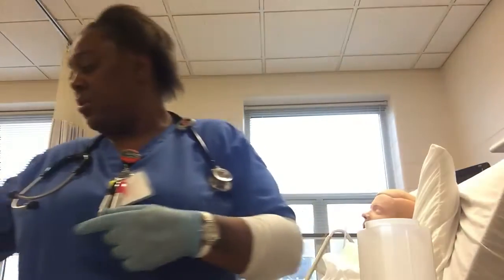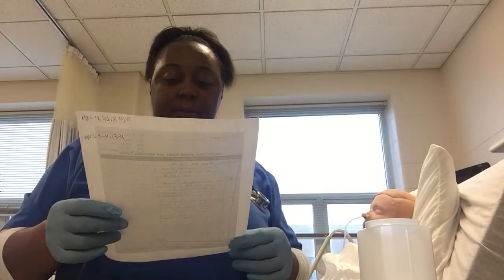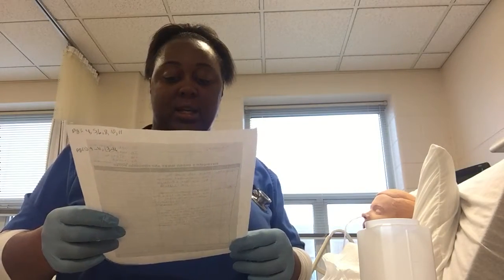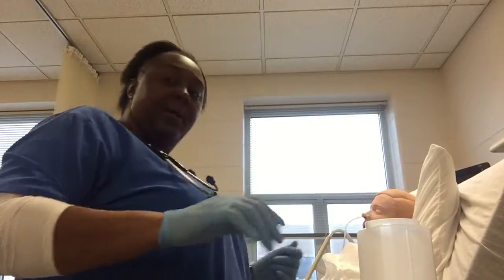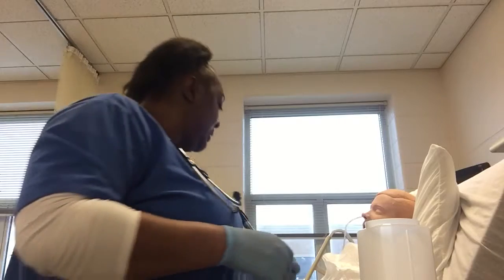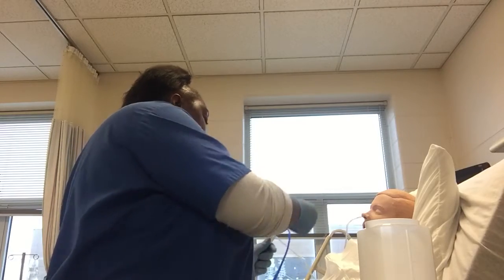Then the next order calls to administer some Glucerna, 100 milliliters with 50 milliliters of water flush per NG tube every 4 hours, as long as the residual is less than 150 milliliters. So with that, I will go back into the patient's room, knock on the door, identify them by 2 means. I will raise them to the proper working mechanics. Then I will get the NG tube, make sure I clamp it, pull that out.